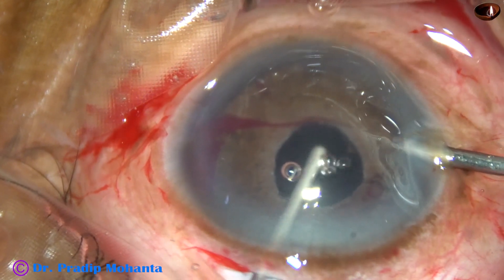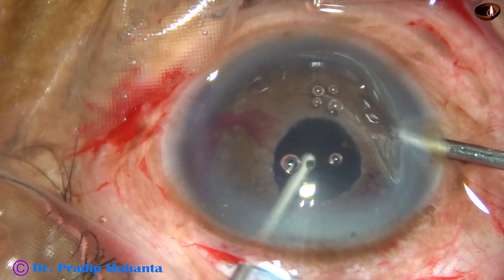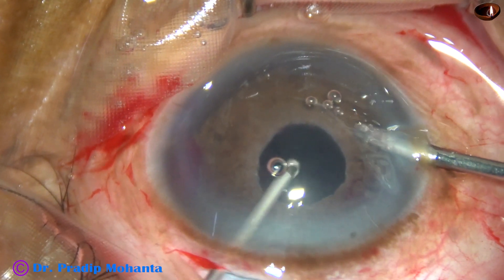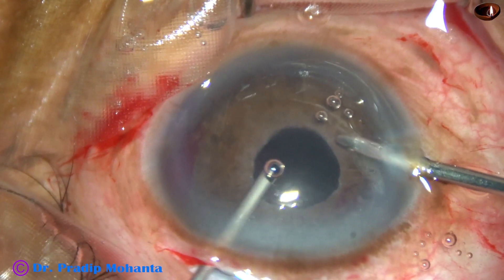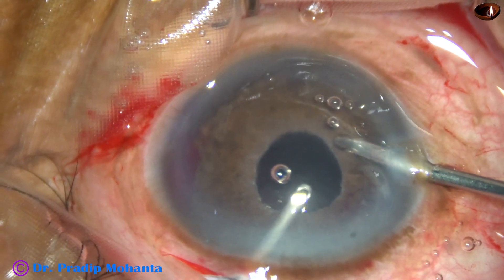And now I do anterior vitrectomy. I am doing this vitrectomy through the main wound. Irrigation is through the right side port. Vitrectomy is being carried out.